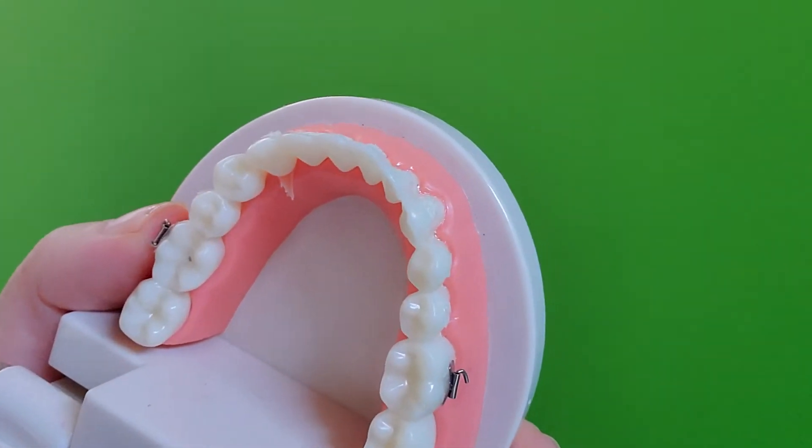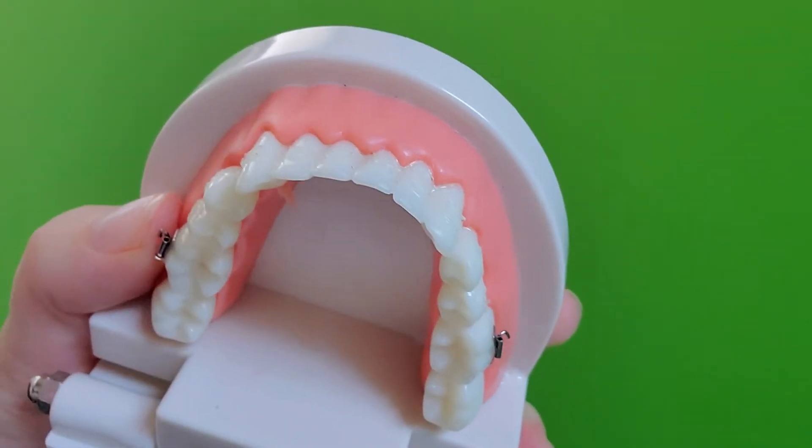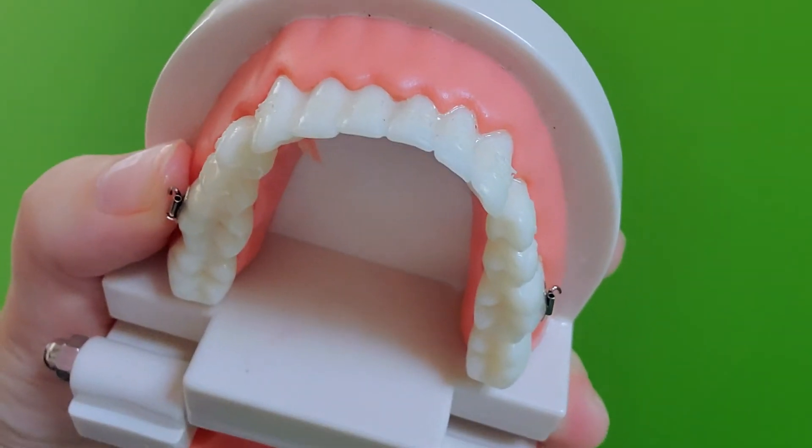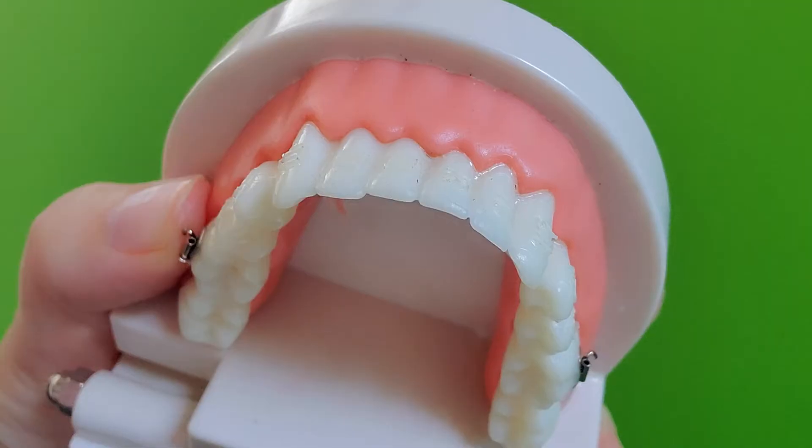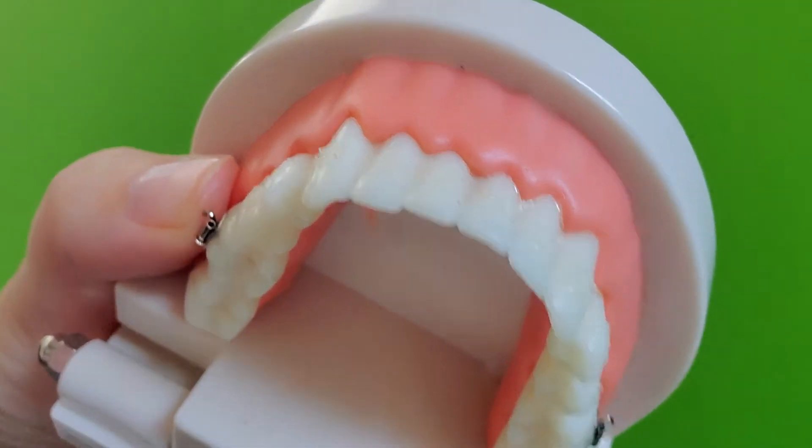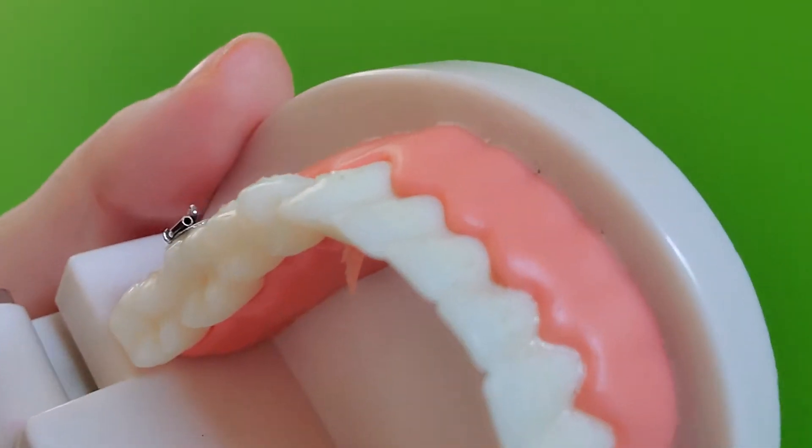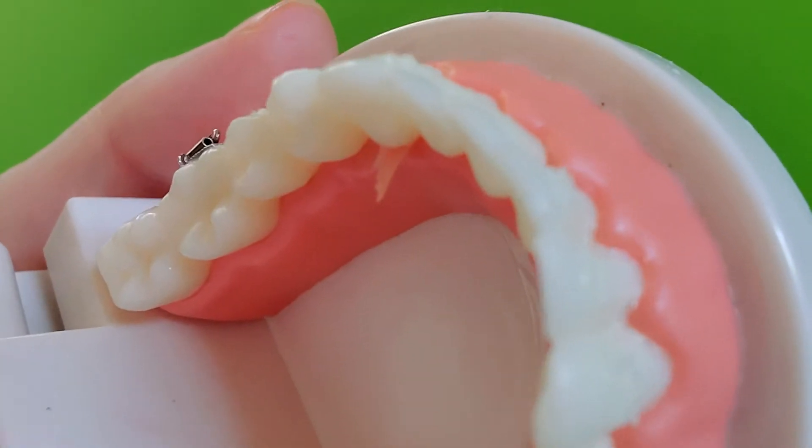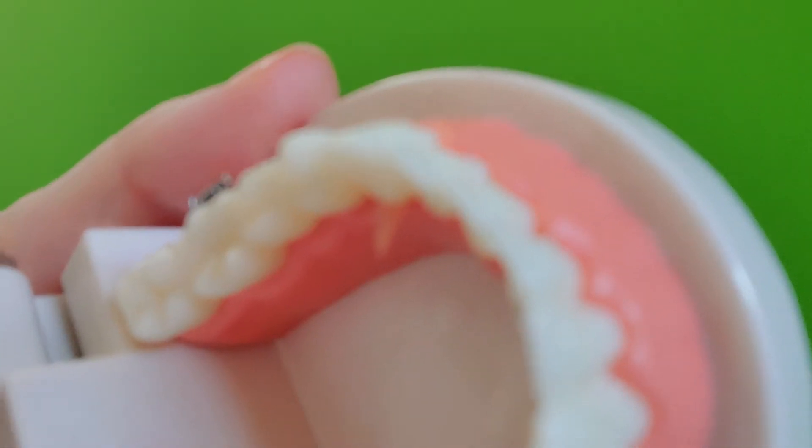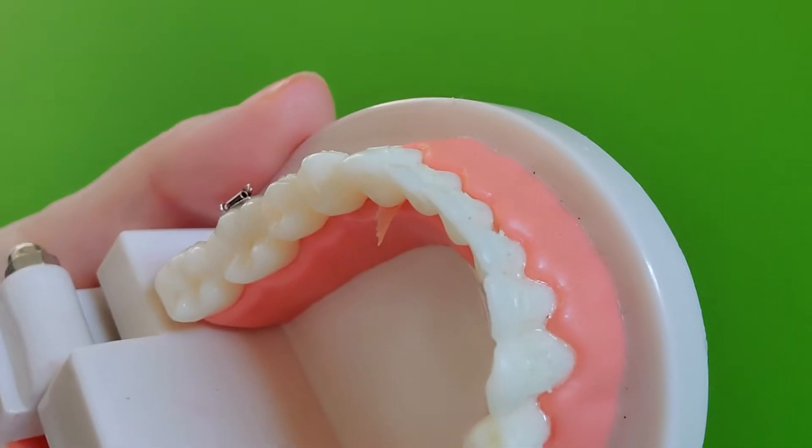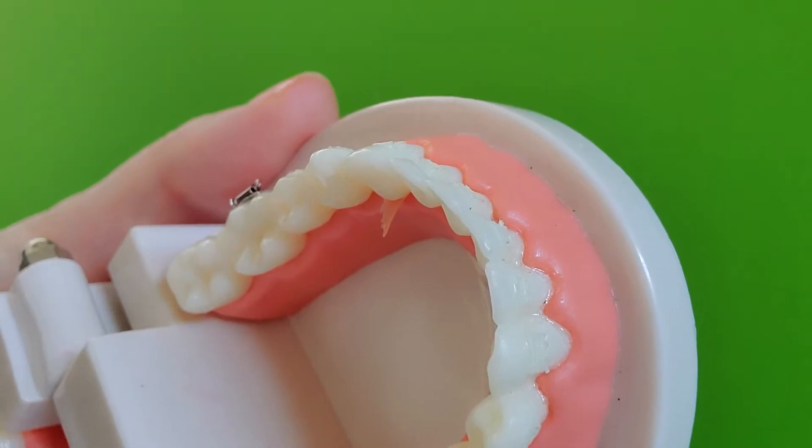Theoretically, you can do this also with attachments, but it doesn't work that well. So let's simulate here. We've got our patient who's had their brackets removed, but you can see there's a lot of adhesive left on the teeth, right? You see that?